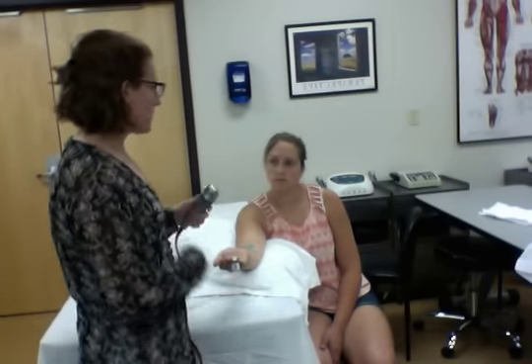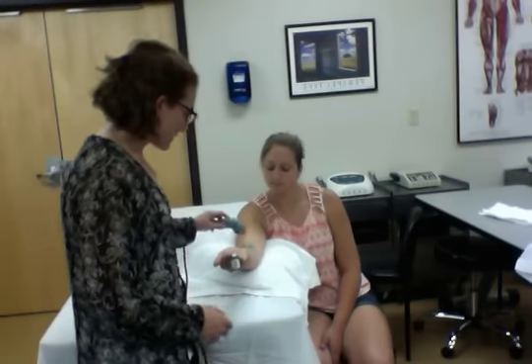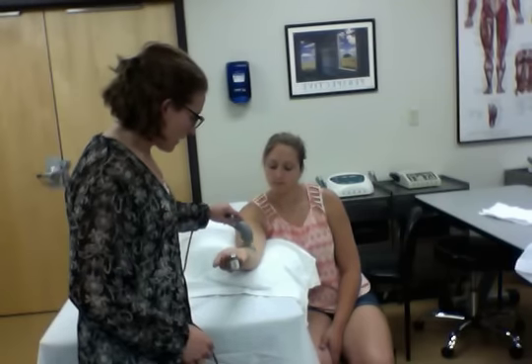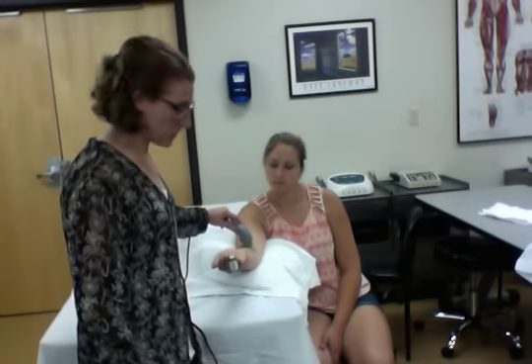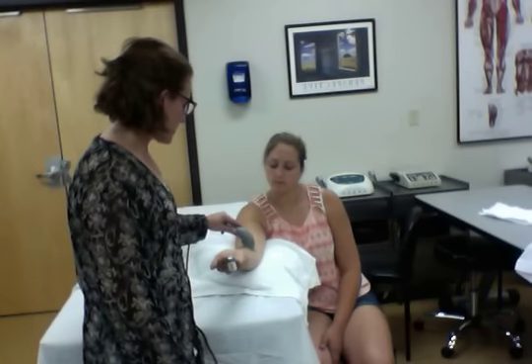Okay. If you feel any discomfort in your elbow or if it feels really hot, just let me know and we'll turn your intensity down. Sound good? Mm-hmm. All right. So I'm going to get my gel going. Go ahead and press start. Make sure the timer's counting down. And it is.